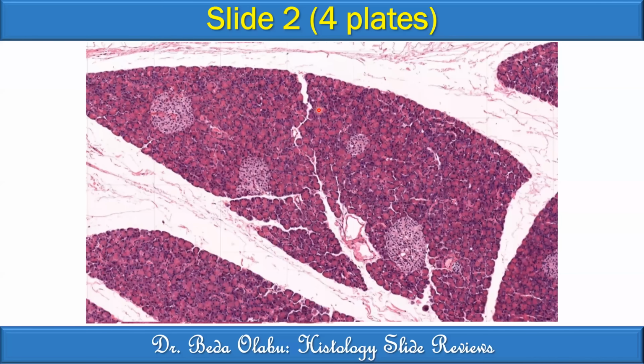Carry on. So I saw, are they the follicular cells or something like that? Okay, you are the one talking, remember? Yeah, in this second slide, I didn't see clearly. Okay, I can take you to third magnification. What is new?